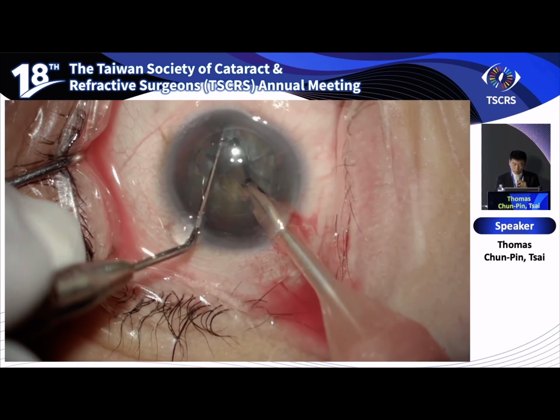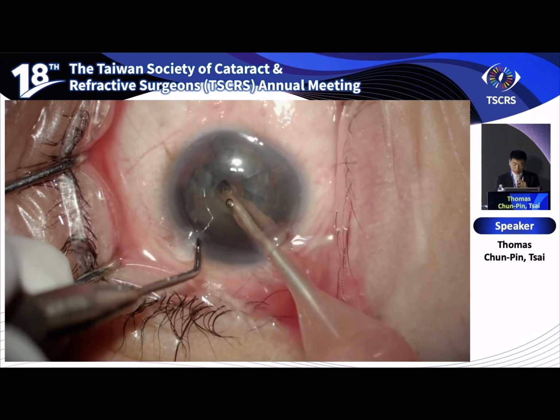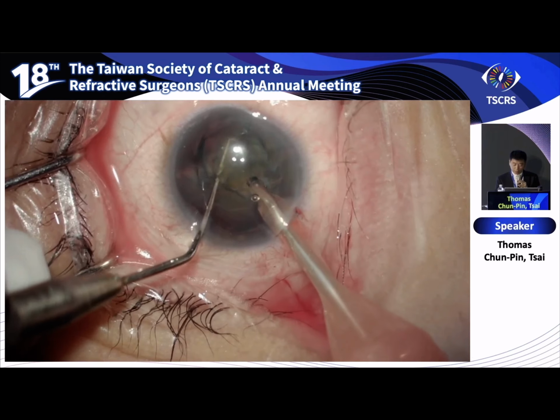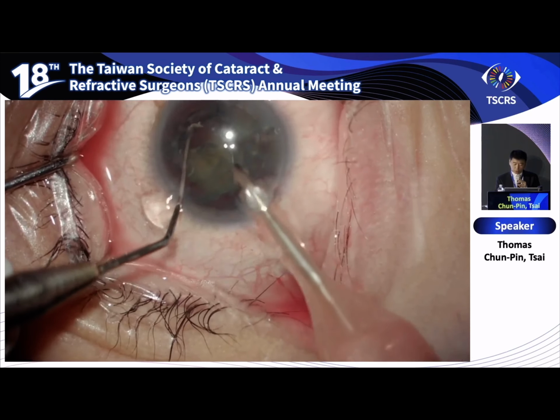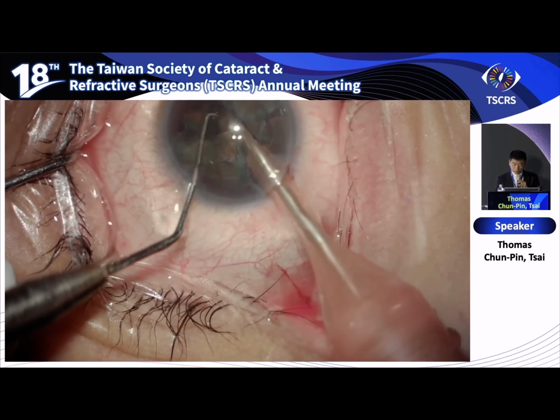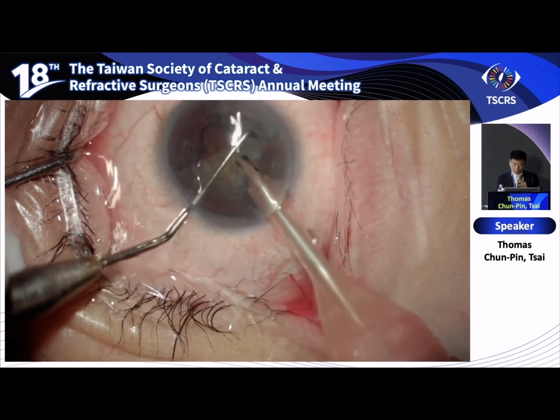We must always remember that it is a myopic anatomy eye. Loose zonules and more fluctuation in the anterior chamber could happen. The incision can sometimes open during the surgery, causing micro or macro perforation. So you must be prepared to close them with sutures if it happens.